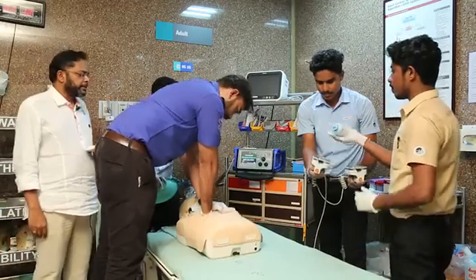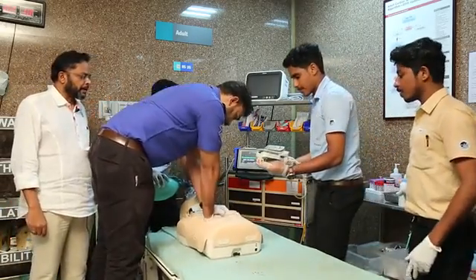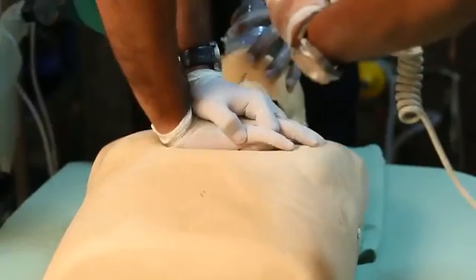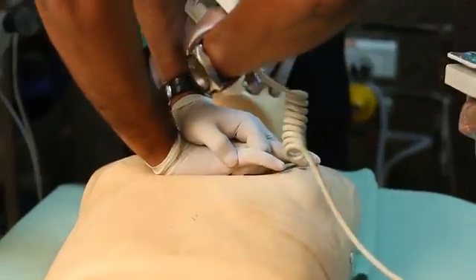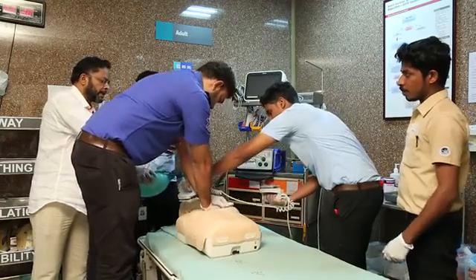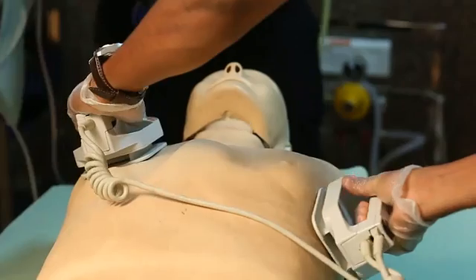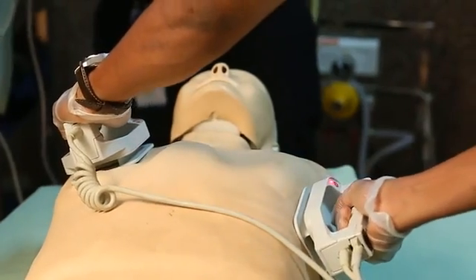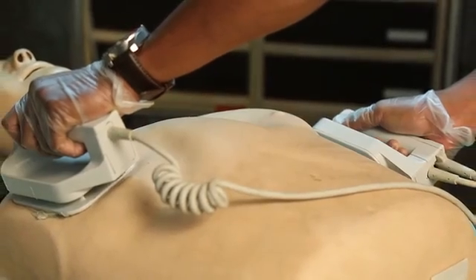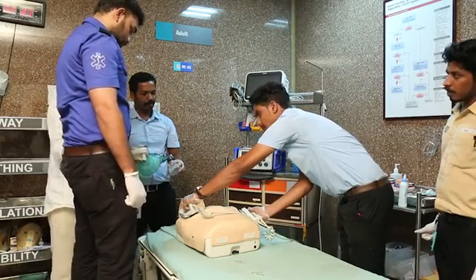He takes the paddle and applies adequate jelly for proper contact. Then he places the paddles — one on the right side and the other on the left side at the apex.